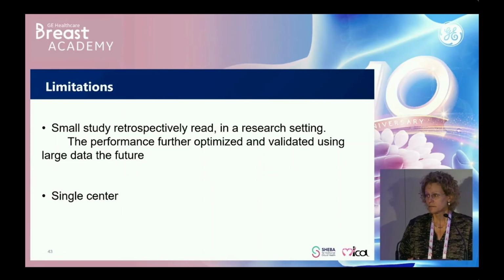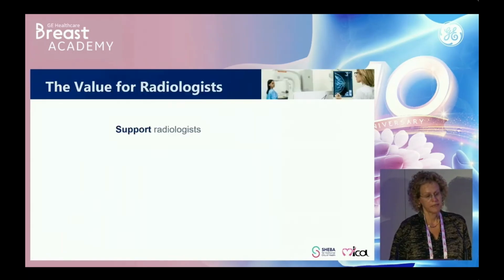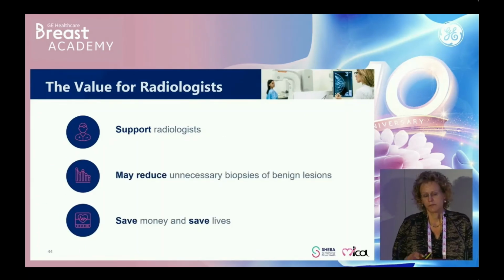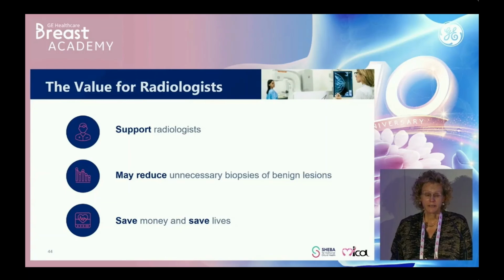Of course, we have limitations of the study. It's a retrospective research study performed in a single center, and it should be validated in larger data. And as we see it, the value of this AI system could be to support our decision whether to biopsy or not to biopsy, to reduce the number of the benign breast biopsies.